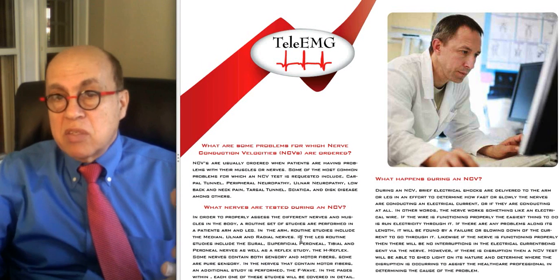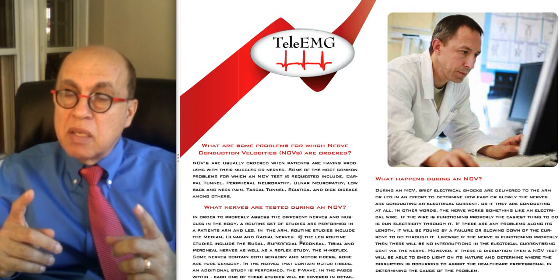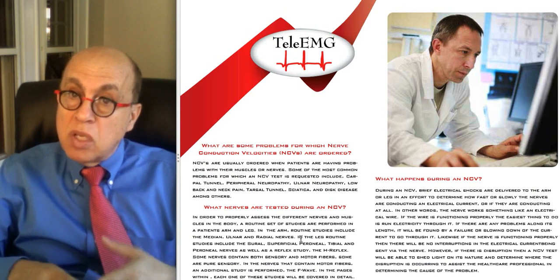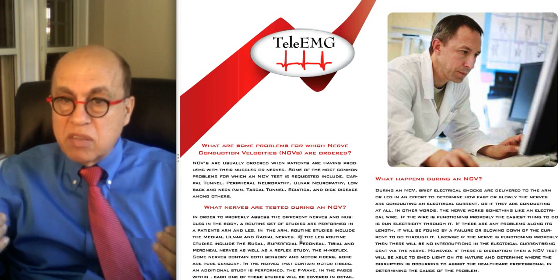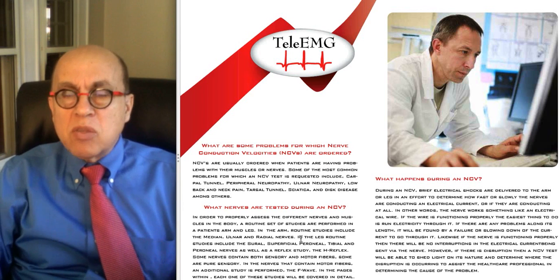Same thing with the needle exam. You're going to tell them that you're going to stick a needle in their muscle, but you're not going to stimulate them with electricity while the needle is there. And two, you're not going to inject anything or draw anything out of that needle. So I think it's always very important to explain to the patient prior to doing the study what you're going to be doing to them.